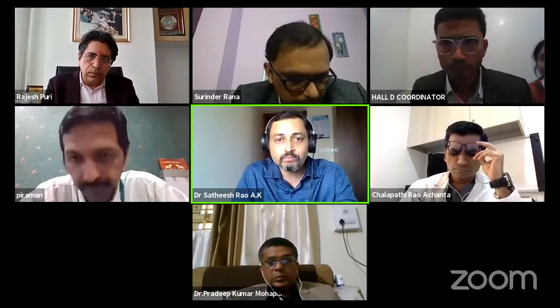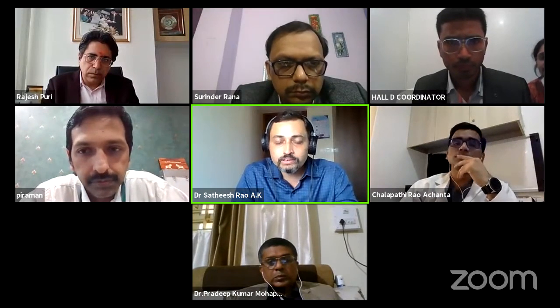As you told, some of the recent literature shows that it's still controversial whether to take a biopsy in some lesions or not. But still, I feel that in the small lesions, maybe 1 to 2 centimeter lesions, EUS-FNB will have some edge before any definitive procedures, I feel. Dr. Chalapathy, what is your take on this?